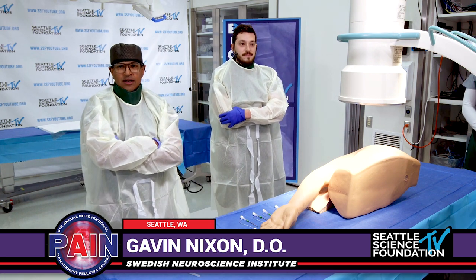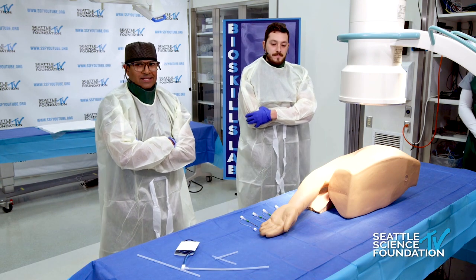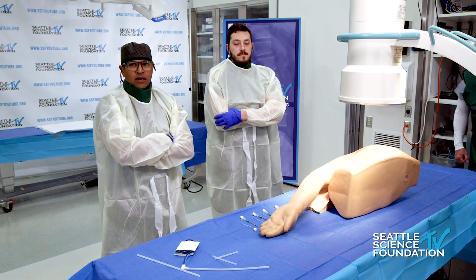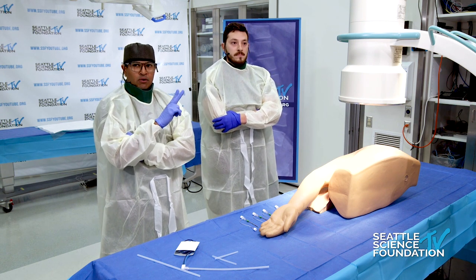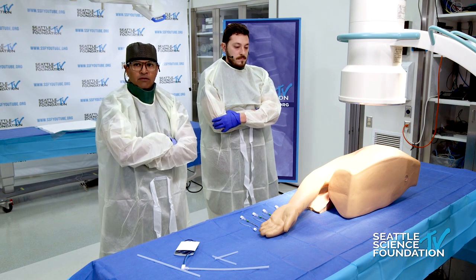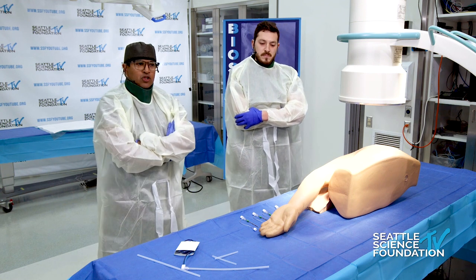I'm going to have Gavin do the entire procedure. What we're going to do is use the technique as described by Dr. Max Eckman for the shoulder joint. You can radiofrequency ablate this joint, and the three nerves we're going to go after are the suprascapular nerve, the axillary nerve, which are both done posteriorly.